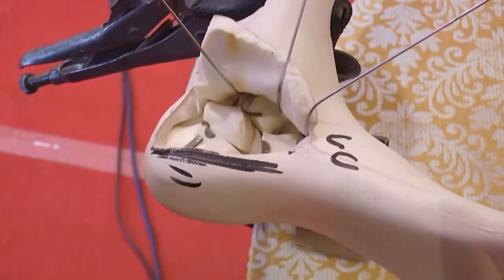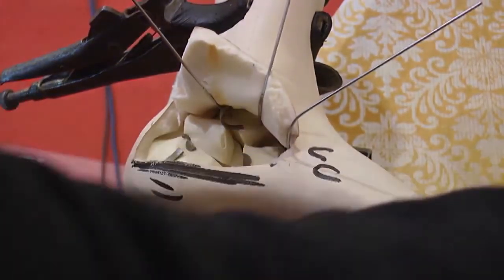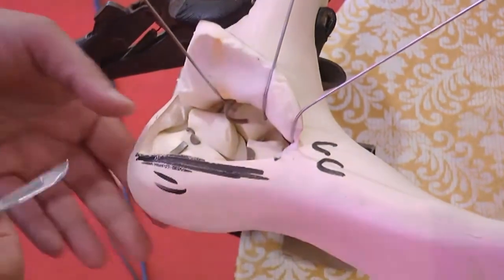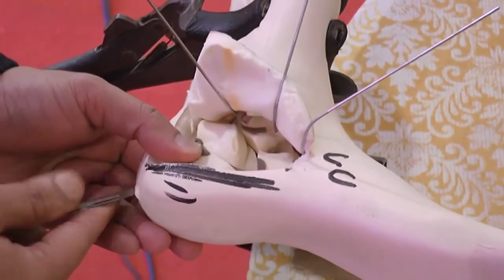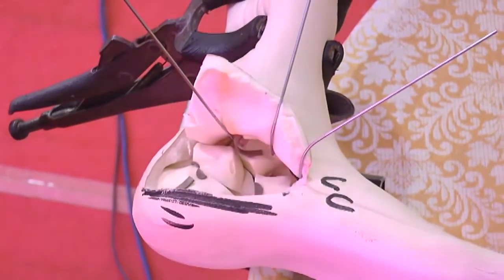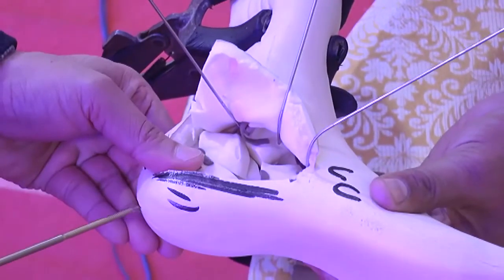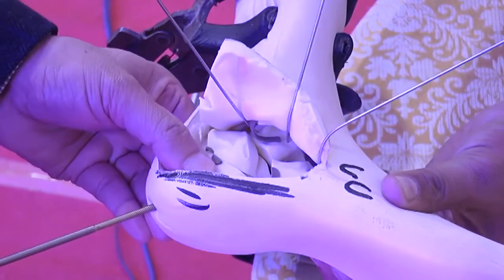That is the next step. Now you have visualized the fracture. The next step is to first align the tuberosities. So we will take a Schanz pin on a drill. Here in this situation, you can do it with a stout Steinmann pin. Most of the times what I have found is that if you use Steinmann pins, the moment you try to manipulate it, it becomes loose and you don't have a purchase in the bone. So I have now started to use a 3.5 millimeter Schanz pin, and I don't use a drill bit, I directly drill it.